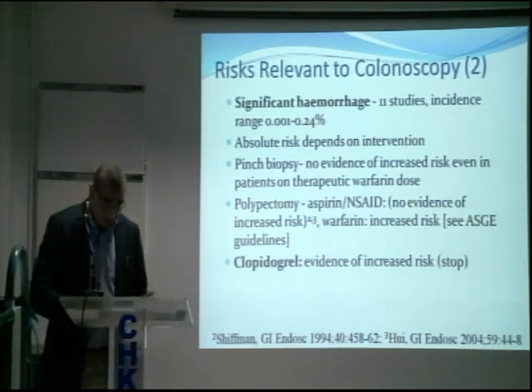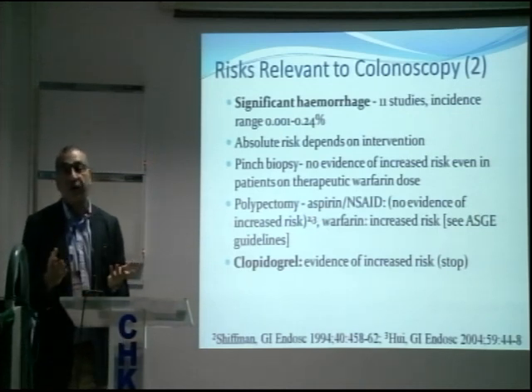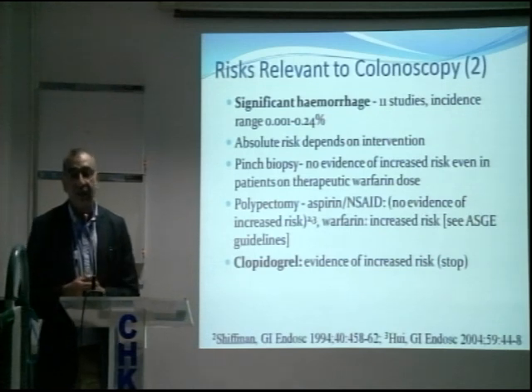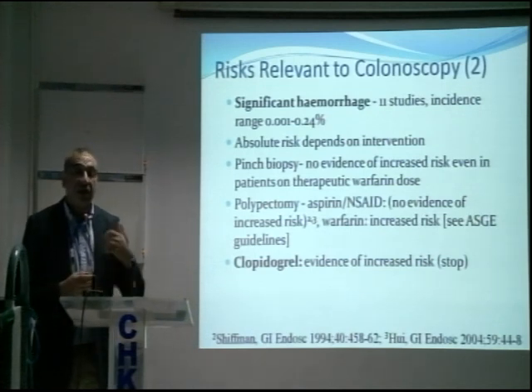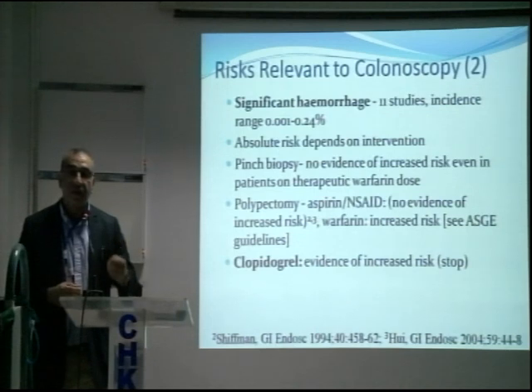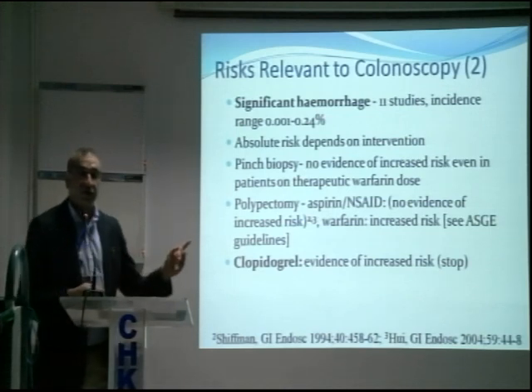Significant hemorrhage. Now, hemorrhage is, again, a well-recognized complication of any endoscopic procedure, colonoscopy included. It again depends on what you do during your procedure. It is highly unlikely, again, in a diagnostic procedure. Even if you take diagnostic biopsies in a patient who is on oral or intravenous anticoagulant or subcutaneous low molecular weight heparin, very unlikely to get hemorrhage from a diagnostic biopsy. So if you are carrying out a colonoscopy on a patient who is on anticoagulants, biopsies are not contraindicated. Hemorrhage is highly unlikely in those situations.